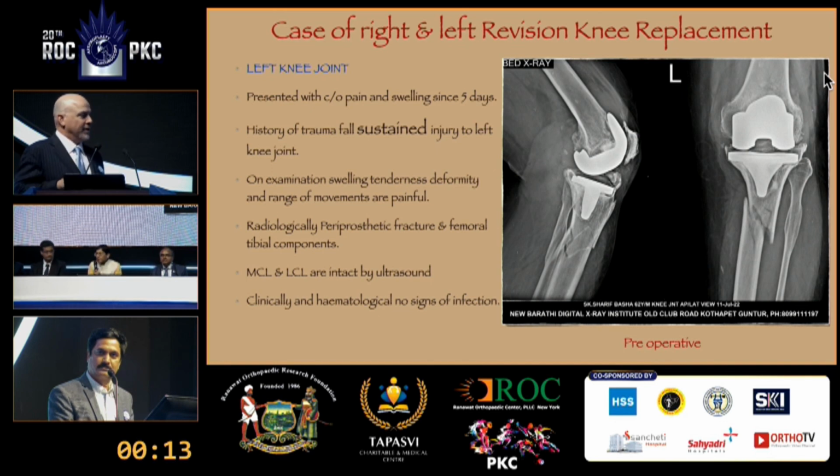Dr. Mohanty, can you put a tentative plate there, just a temporary plate? Okay, so that's the plate, and then go ahead and do everything. Yeah, that's what I was telling. You can temporarily put a unicortical plate with unicortical screws there, then ream the tibia, and then you can go ahead with it. That should not be a problem.